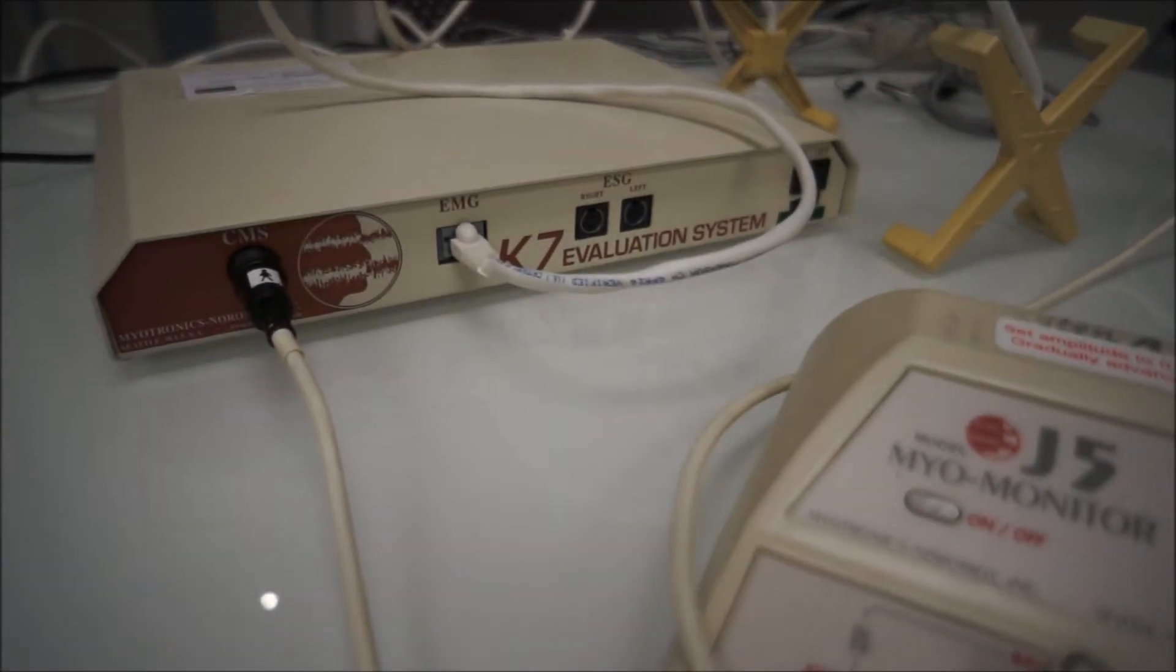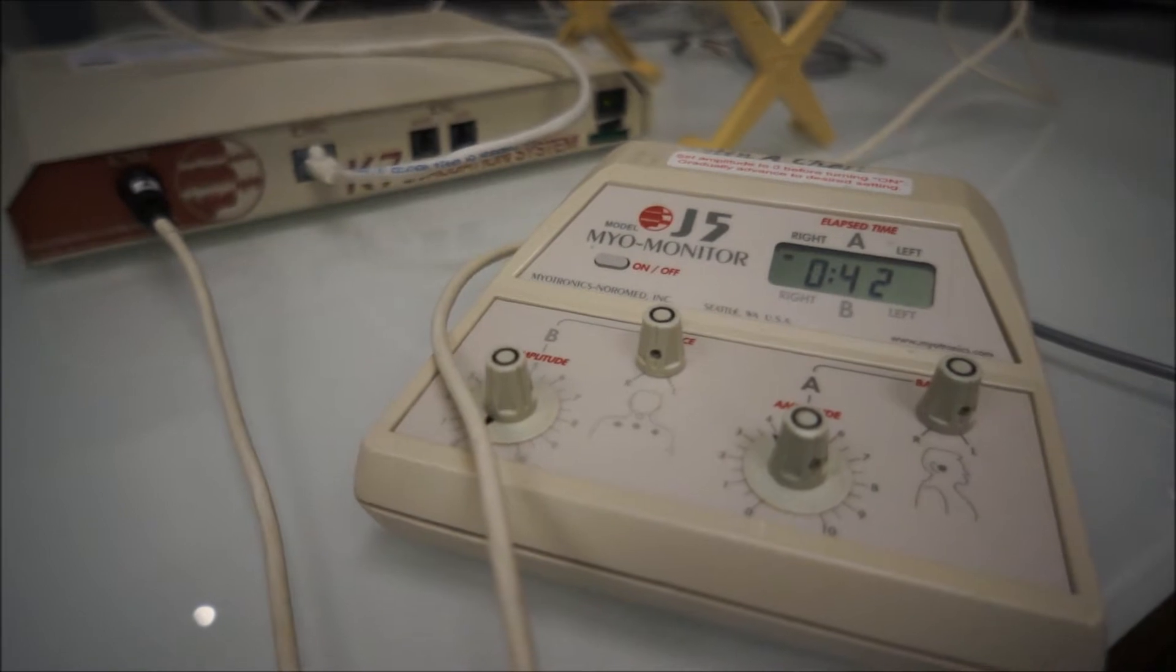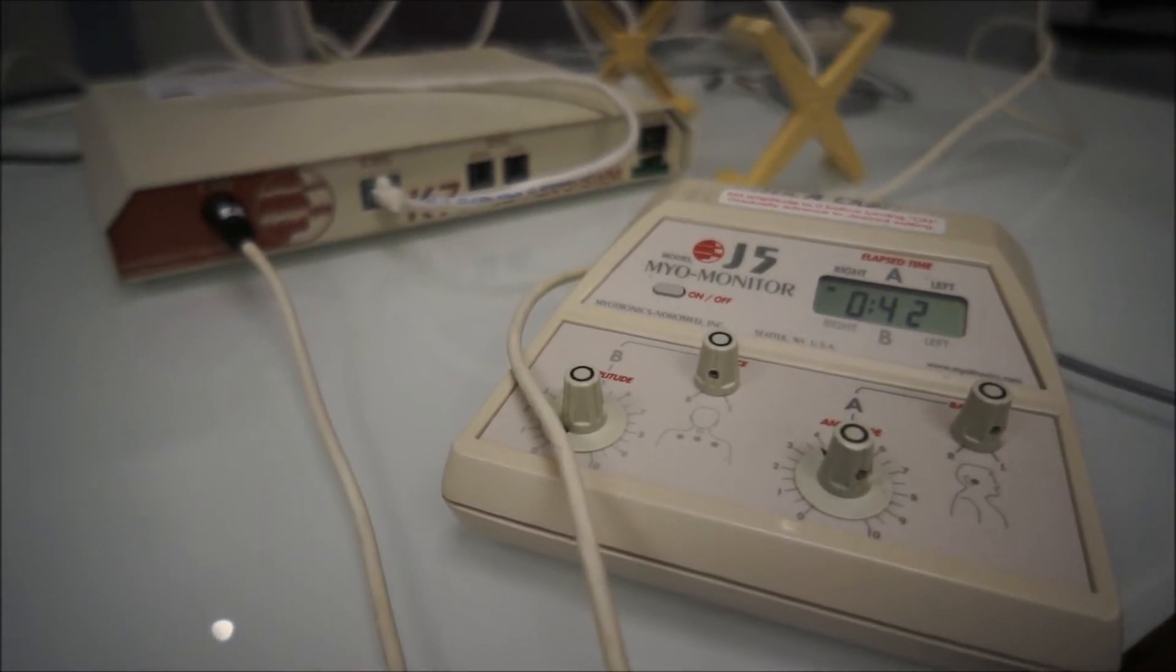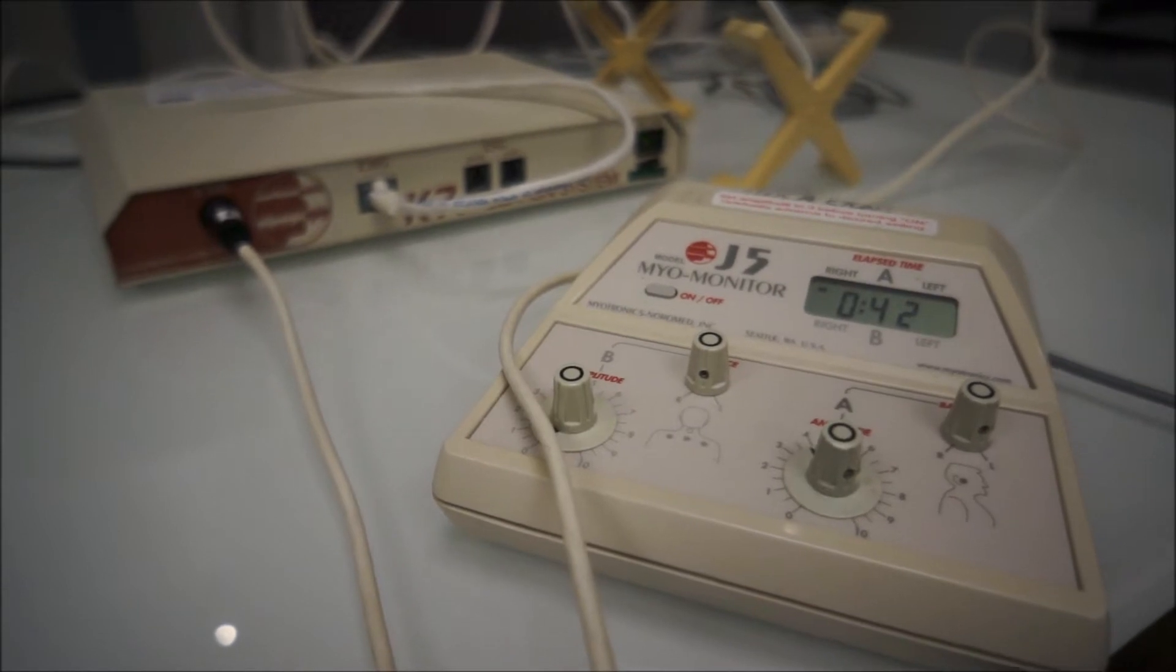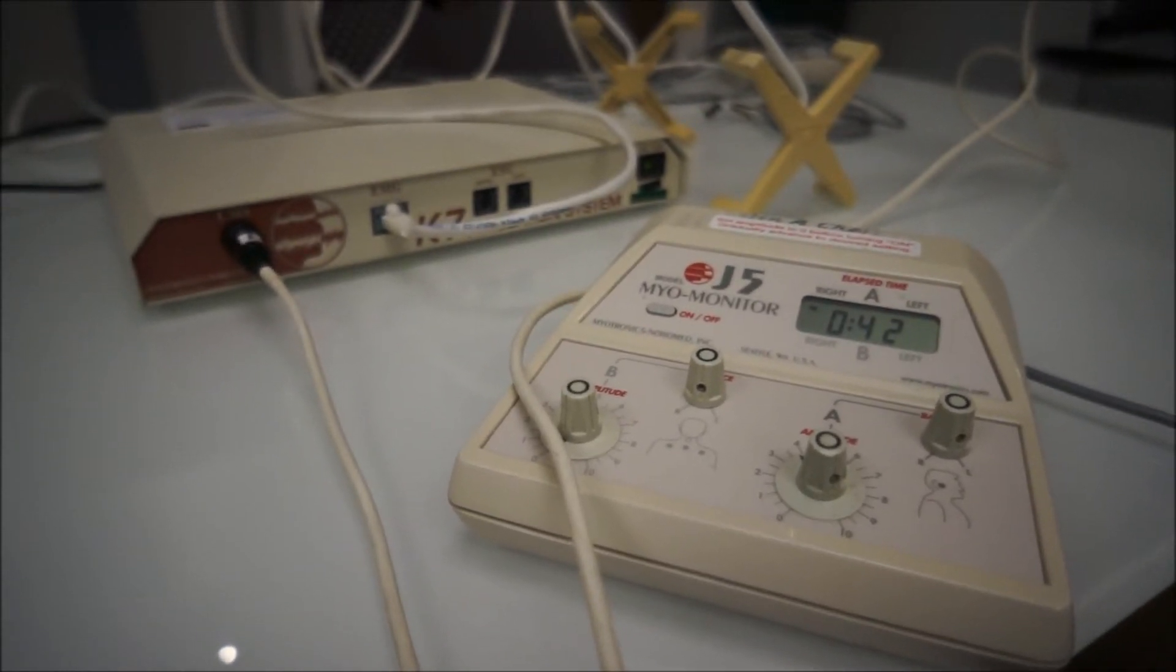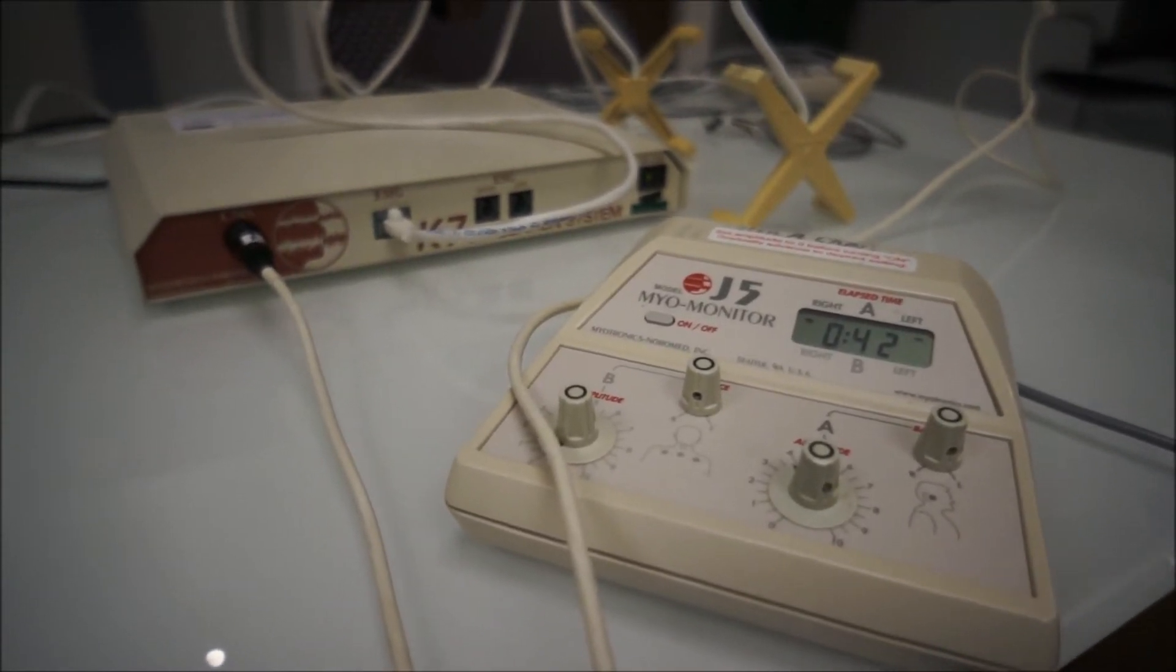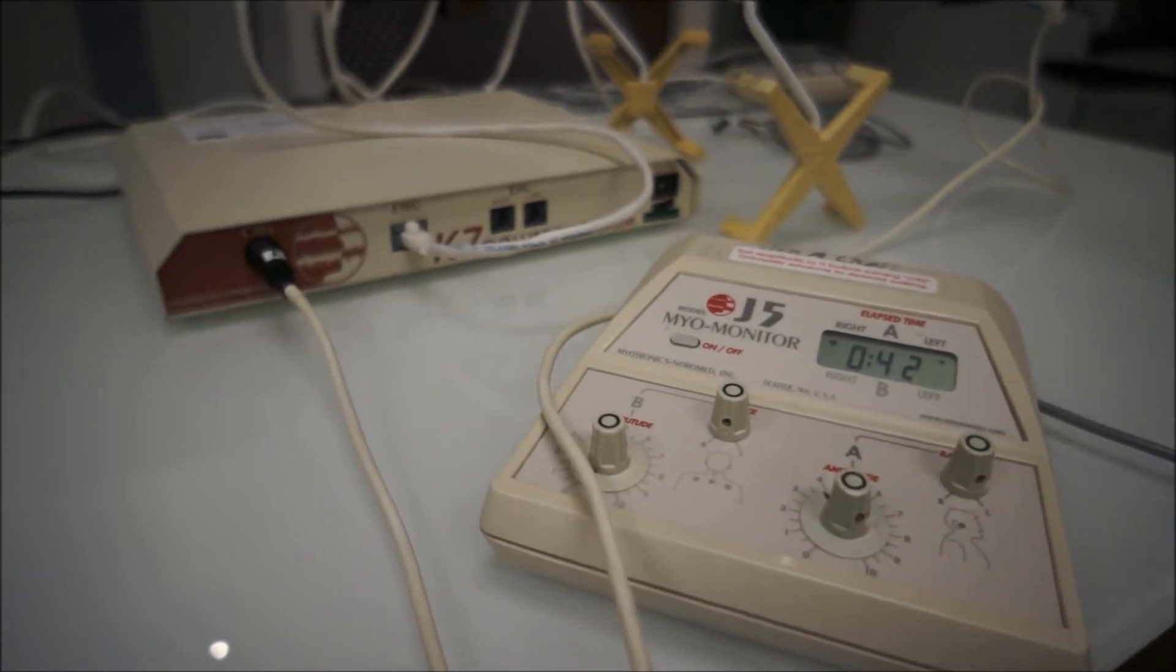All right, so here is our K7. We have a Myo Monitor, and the reason why we have and use the K7 and the Myo Monitor are two things. Number one, we use the Myo Monitor to basically remove the torque and the strain and any of the abnormal pathologies as far as muscle tension out of the bite.